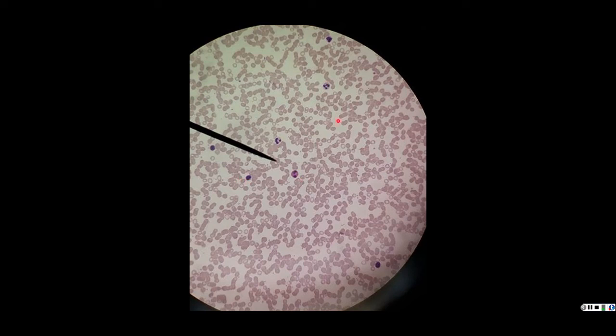And that's really kind of a good description of the different types of things that make up blood on the microscope slide. So let's take a look at exactly what we're seeing, and then we'll go through some more specifics here in just a moment.